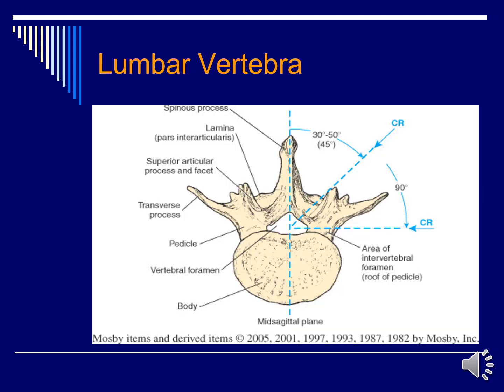Looking at the superior portion of the lumbar vertebra once again, you see that the superior articular processes sit at about a 45-degree angle between the body and the spinous process. This is going to be important when positioning for the oblique lumbar spine.